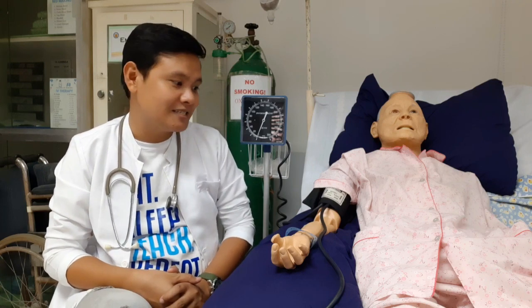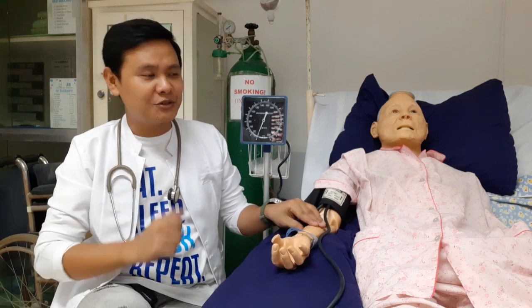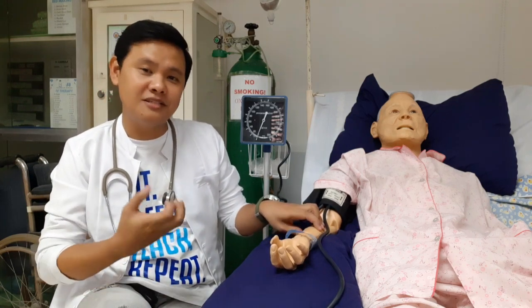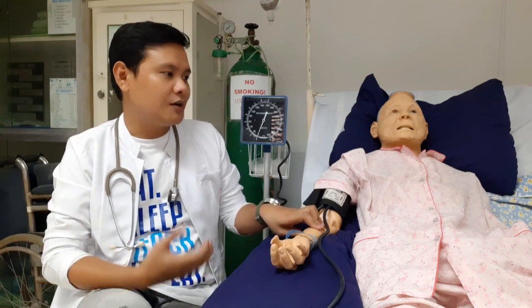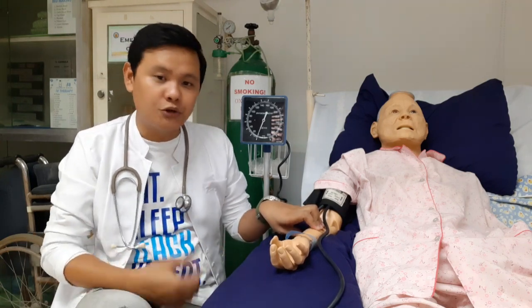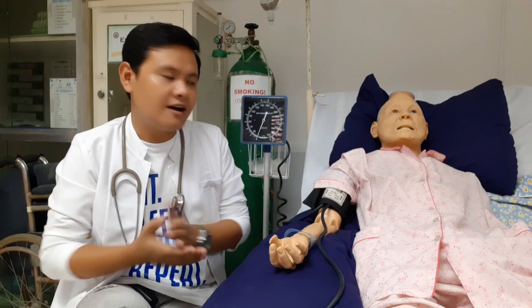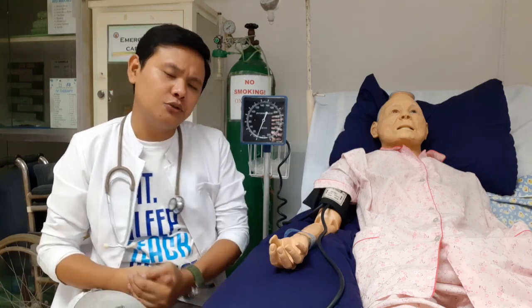So prior in doing the procedure, you have to introduce yourself and verify the client's identity using the agency protocol. Na-mention ko naman sa inyo to before regarding the GIVE. Okay, you have to greet your client, introduce yourself, verify, and then explain what you're going to do, why is it so really necessary, and how your client will participate in this procedure. So after that, wash your hands and observe appropriate infection control procedure.